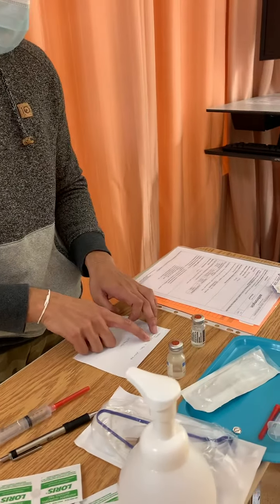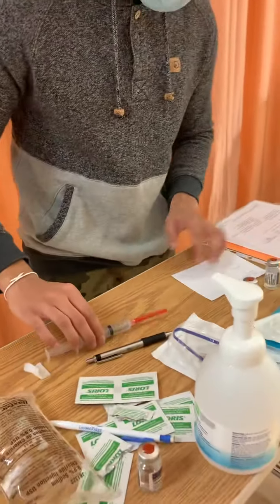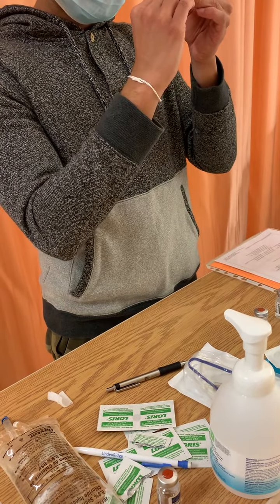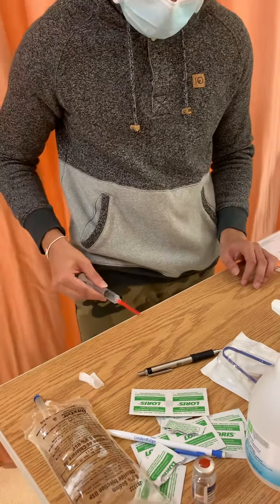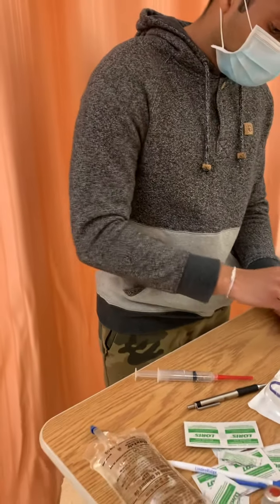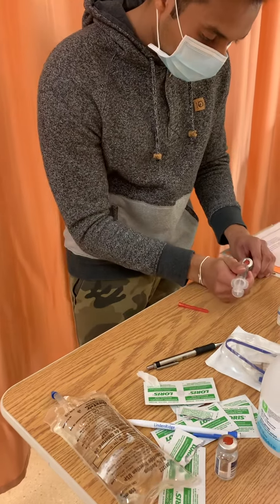So for a 400 milligram ordered dose and a 500 milligram vial, we're gonna draw out 4 ml. And we show our calculations. The calculations are shown. And now we're just going to draw the medication out. So we have 4 ml of air we're gonna inject in to draw out the 4 ml that we need. So we're just gonna swab this for 30 seconds, let it dry for 15. Okay, I'm gonna inject the air in.